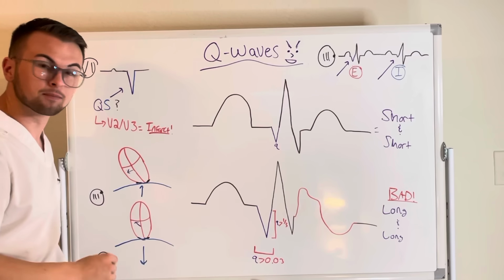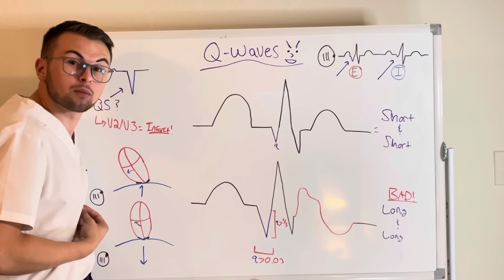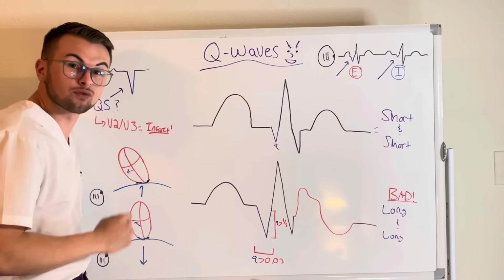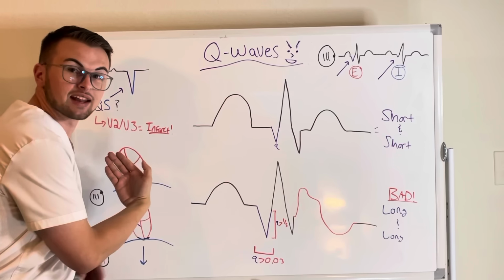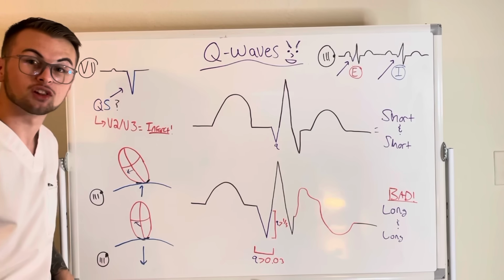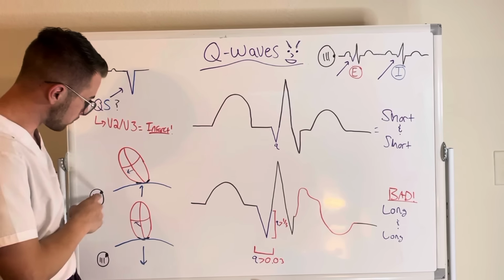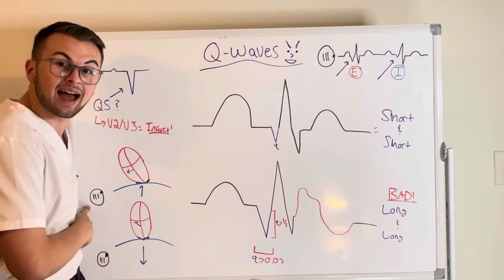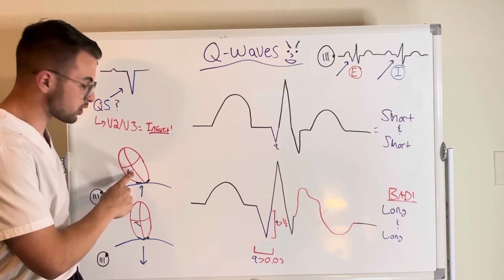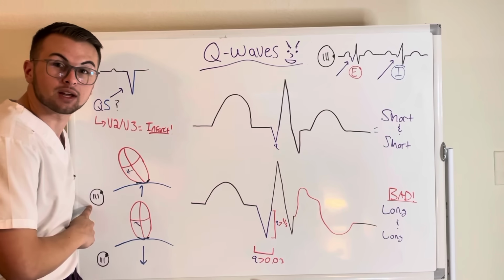So let's think about it. At rest, when the diaphragm is lifted, the diaphragm muscle is relaxed and it is closest to the head. Therefore, the heart is leaning at its normal sideways angle. If we are measuring the heart's electrical vectors in this moment, we see that our Q wave, shown here in purple, is pointing directly at our lead 3. Remember, the Q wave, the interventricular septal depolarization, is pointing right at our lead 3.